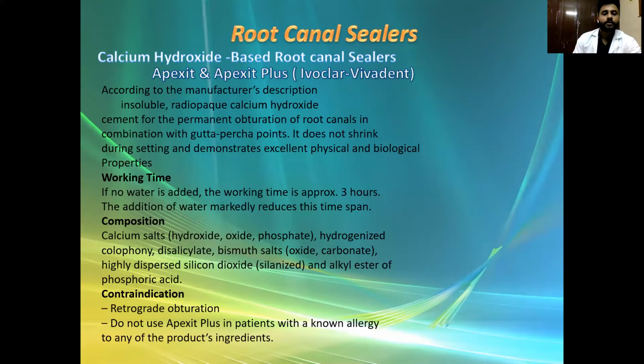Now so far we have seen the zinc oxide eugenol root canal sealers. Now let's go on to calcium hydroxide based root canal sealers. So we are going to see Apexit and Apexit Plus.